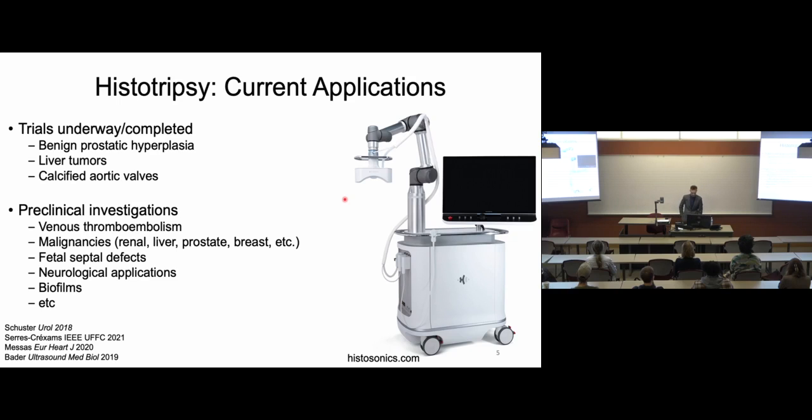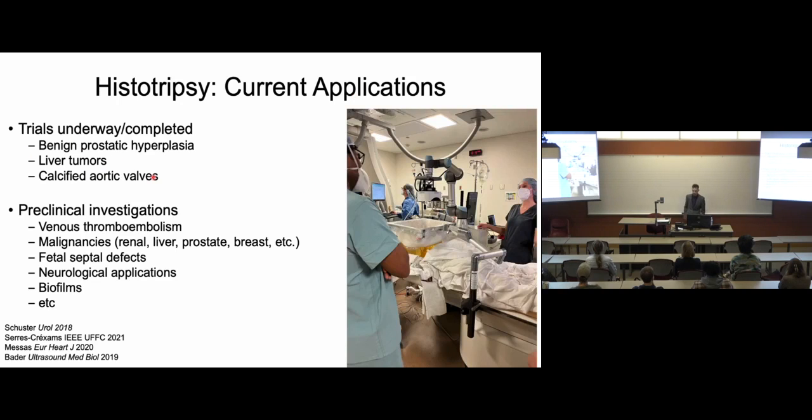This is a company called HistoSonics that's developing the Edison technology. This is the device that's being used to investigate liver tumors currently. We're actually one of the sites for this clinical trial. And this was our first patient. So you can see here the commercial device being wheeled into place. This is a water bolus that's coupled to the patient in order to allow the transmission of the ultrasound energy into the patient. And so that was exciting, to treat our first patient.